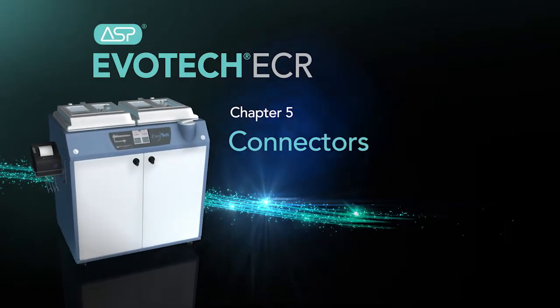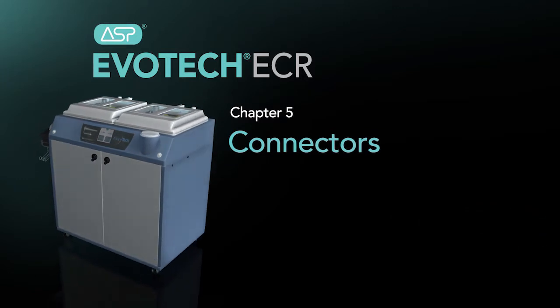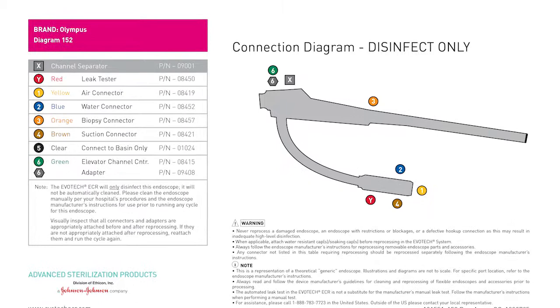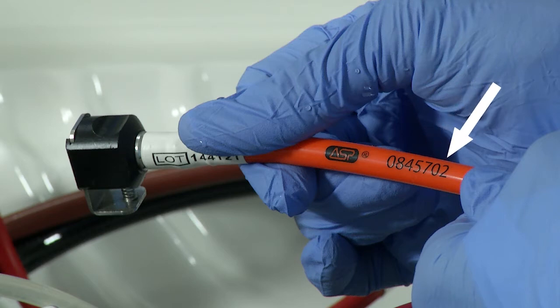Your account manager will supply you with connector diagrams after you provide an accurate list of scope models used in your facility. Connector diagrams are identified by the first 5 digits of the connector part number. There are 7 digits on the actual connector. The last 2 digits reflect the revision number to be used when ordering parts.